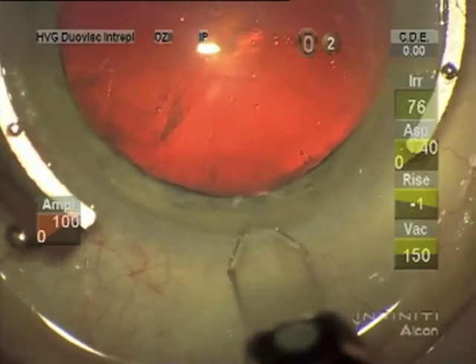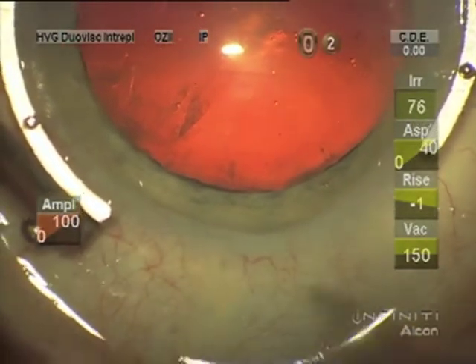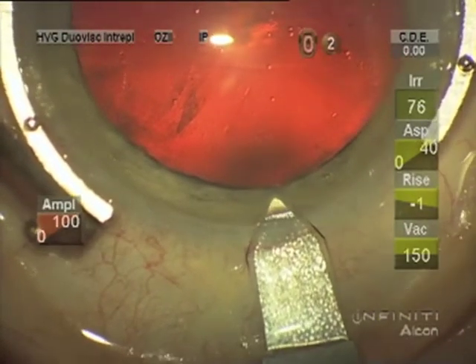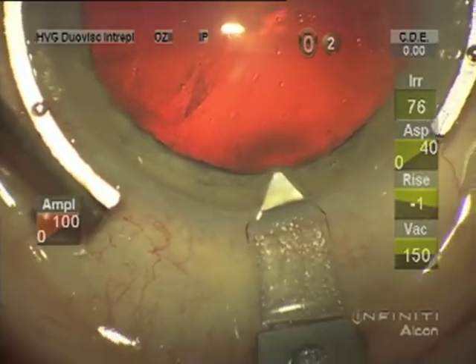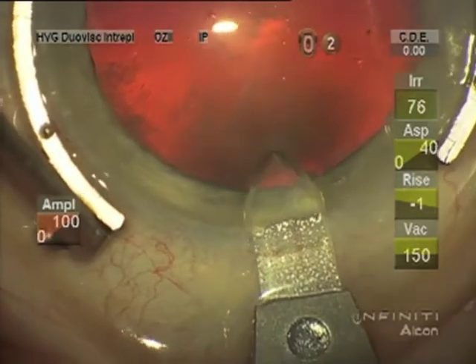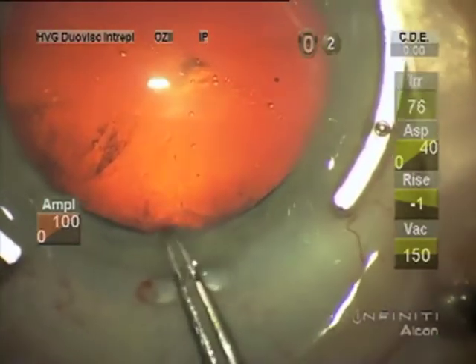For the incision I make a little groove with this diamond knife, 2.2 millimeters by Mastel. I make an incision that's about as long as it is wide, and I'm stabilizing the eye with a fine Thornton ring.